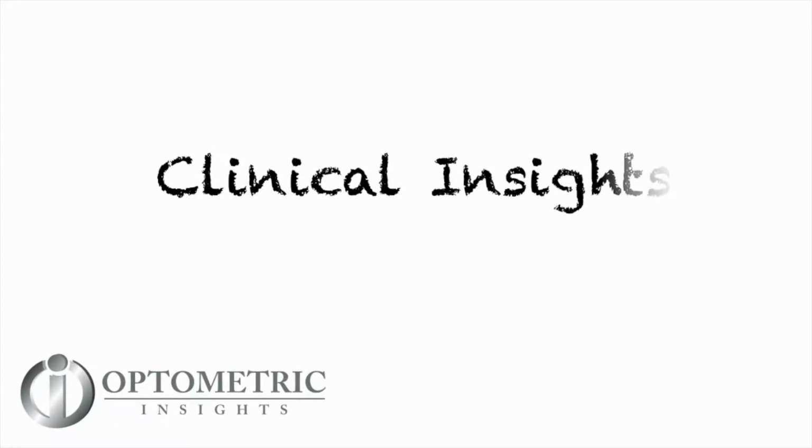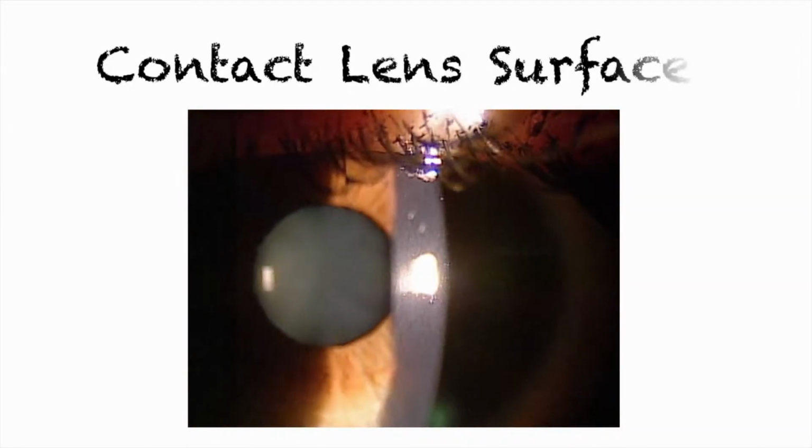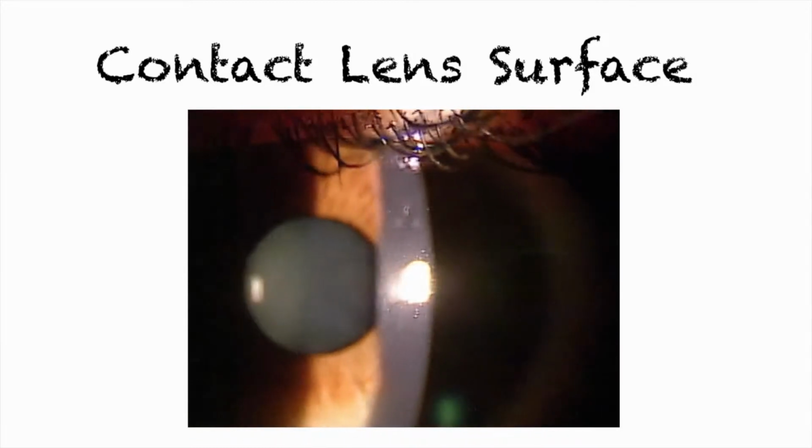Contact lenses continue to be an important part of our practices. As such, a discussion of the ocular surface that supports lens wear is critical. Our patients' environments are challenging. As can be seen here, contact lens surface drying is an unfortunate byproduct for many lens wearers.